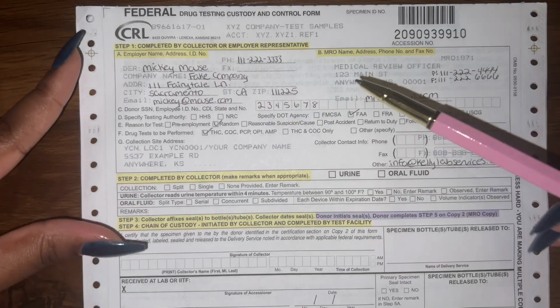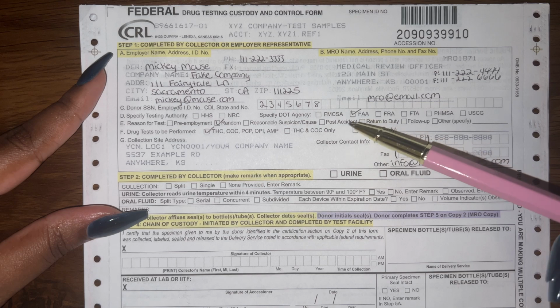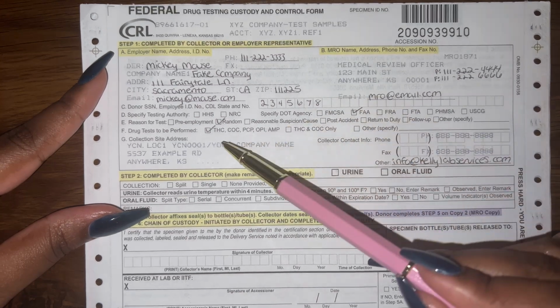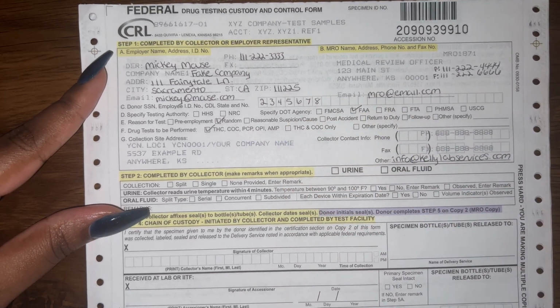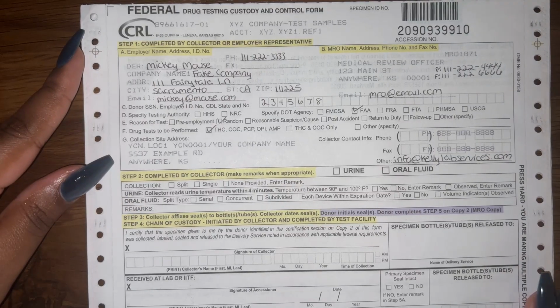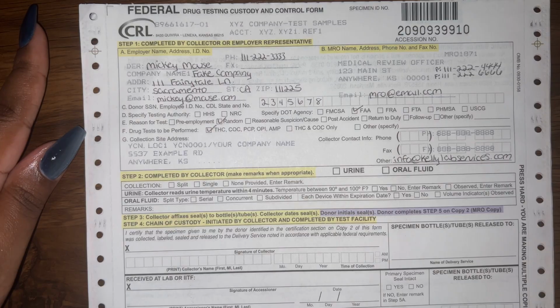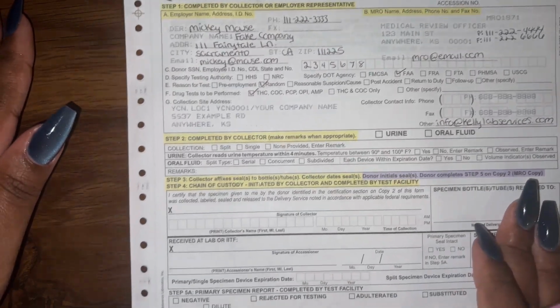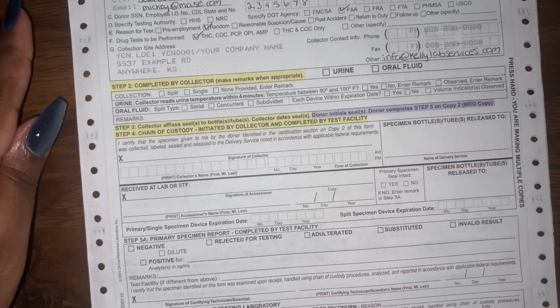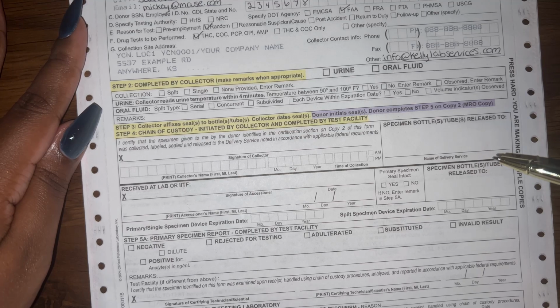Okay, so you've got all of the information here about the donor, the test type, the DOT agency, the reason for the test, and the test to be performed. Collector information, you can always write your email address here on this other line here. Okay, now once we have told the donor to go into the bathroom, provide us with 45 milliliters of urine, do not flush the toilet, do not wash your hands, and bring it out, the donor ended up bringing us a specimen that is outside the temperature range, so now we must document that on our CCF form.